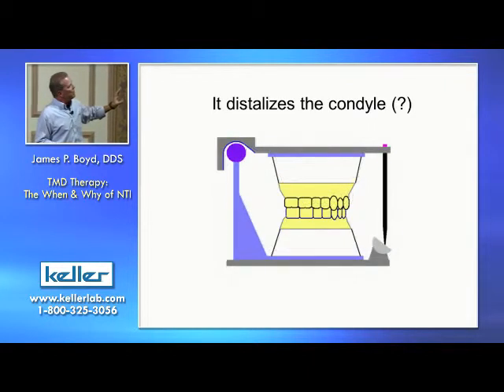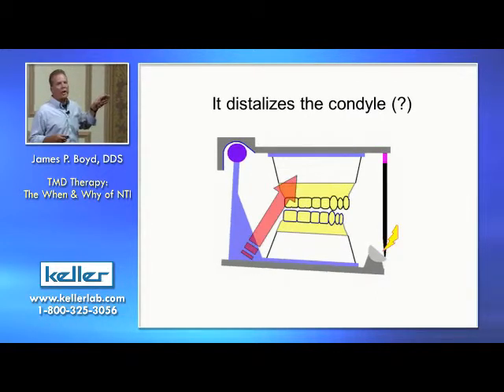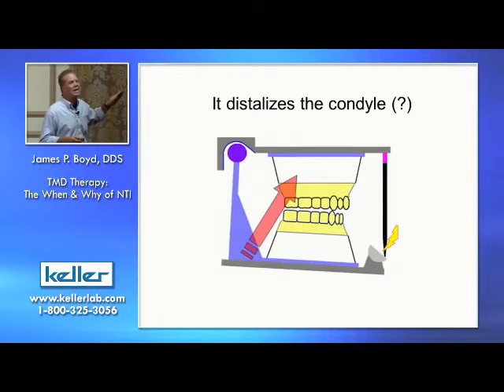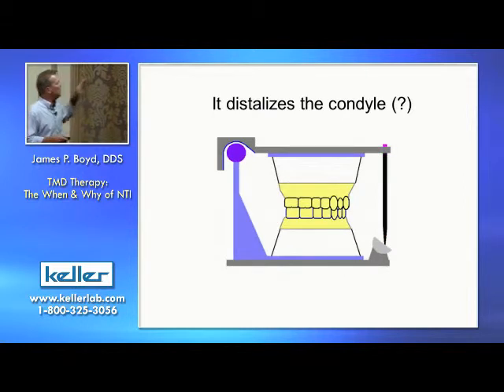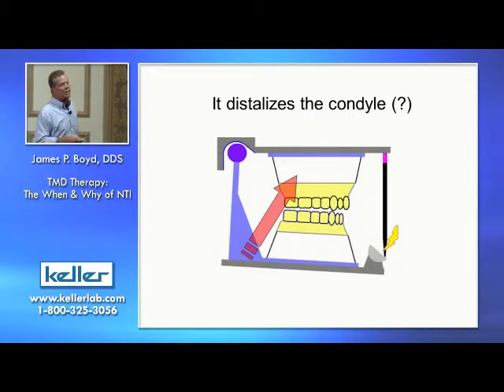If you could just make the articulator the way it's supposed to be, with the maxilla stable, muscles of elevation only have their unique orientation. Their design is always superior anterior. There isn't any other way for that condyle to go than superior anterior. It doesn't matter what happens out here. The force vectors are always the same.